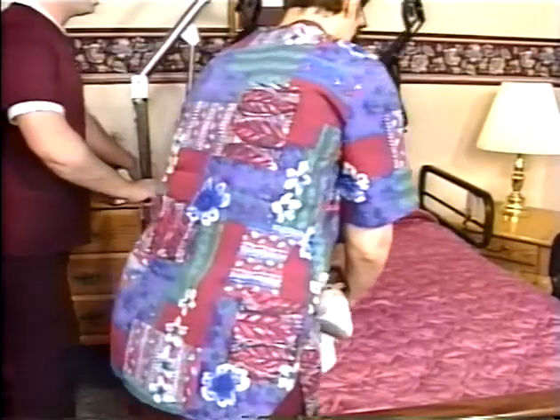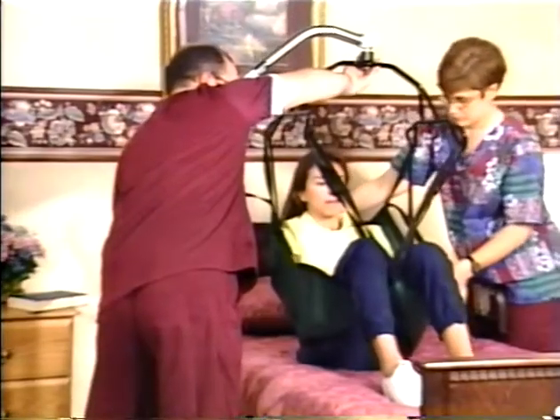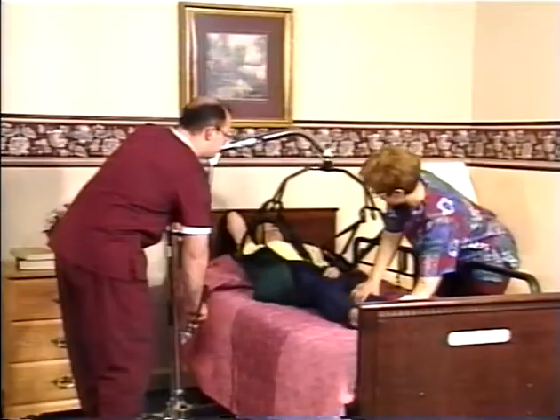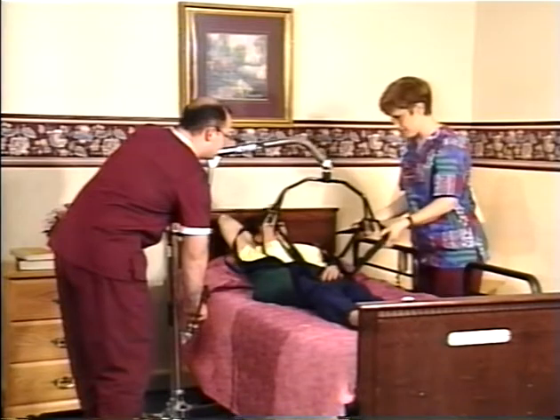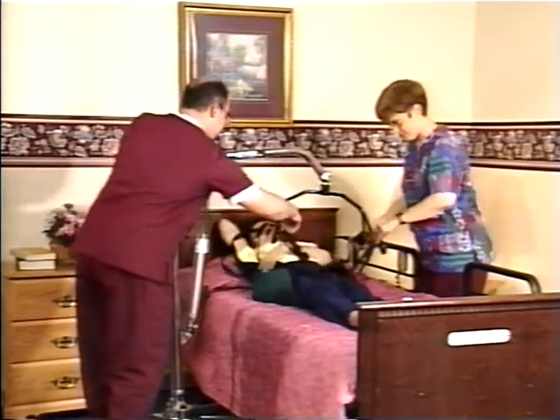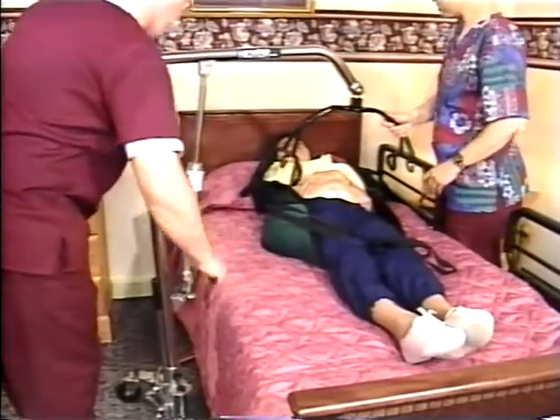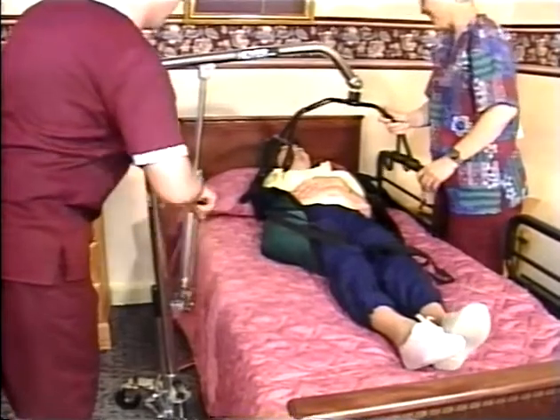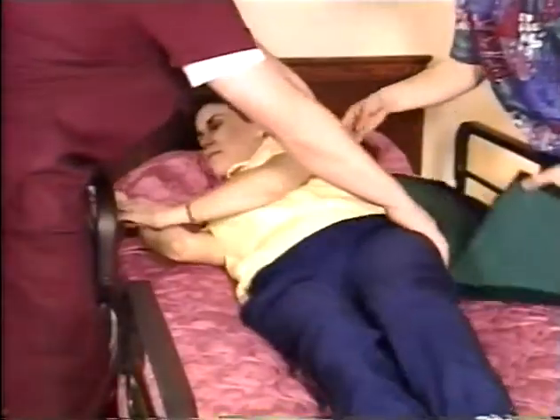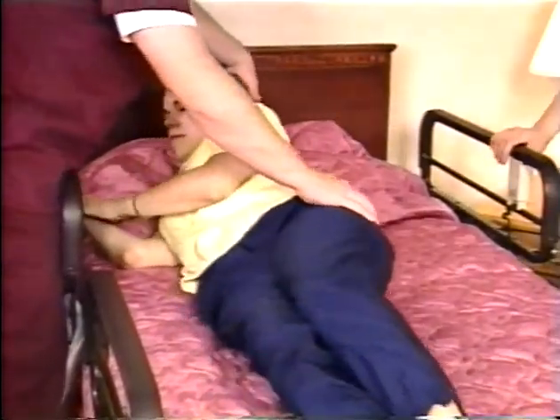Now, lift her legs and rotate them over the bed. Carefully lower her onto the bed. Lower the cradle until there's no weight on the loops. Unhook the loops from the cradle. Raise the cradle slightly and move the lifter out of your way. Use the log roll method to remove the sling. It's as easy as that.